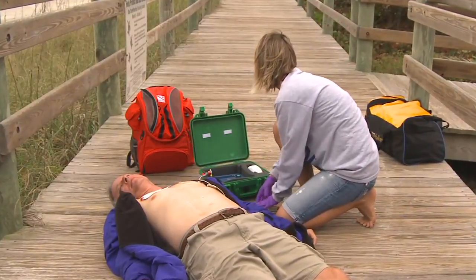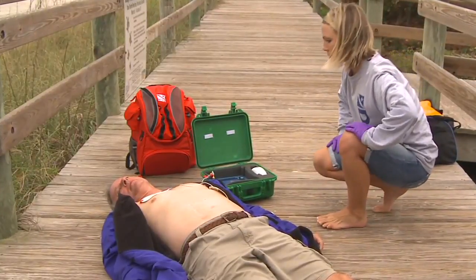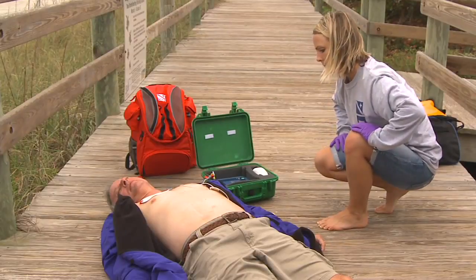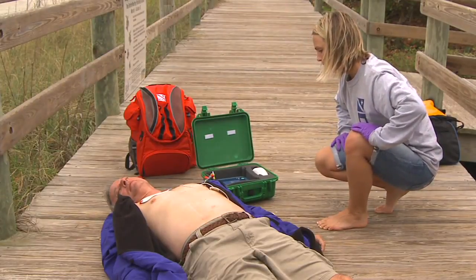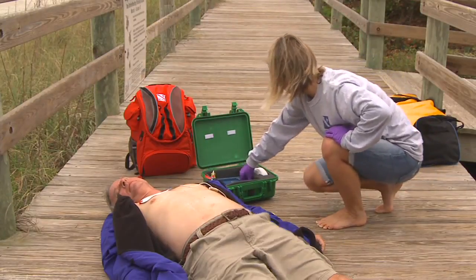Stay clear of the patient. Analyzing heart rhythm — everyone clear? I'll clear. Stay clear of patient. Analyzing heart rhythm. Shock advised. Stay clear of patient. Shock delivered.